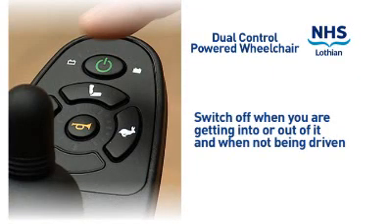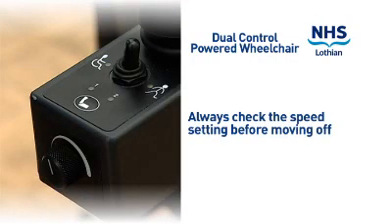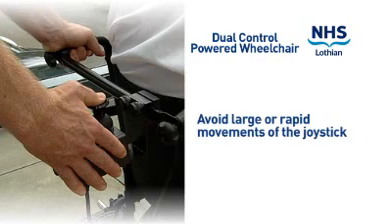Remember, for safety, the powered wheelchair should be switched off whenever you are getting into or out of it and when it is not being driven. Always check the powered wheelchair speed setting before moving off. Avoid large or rapid movements of the joystick when driving the powered wheelchair.